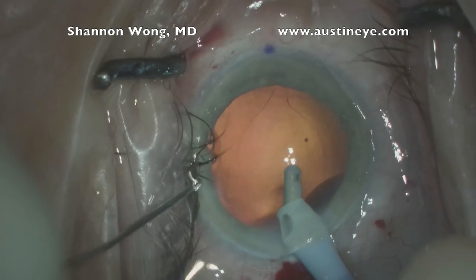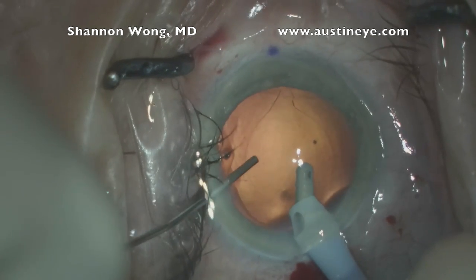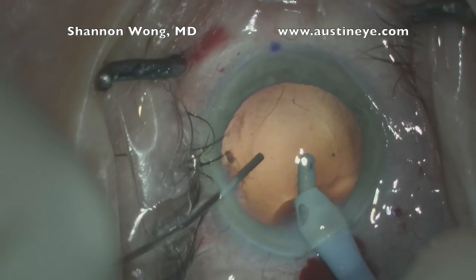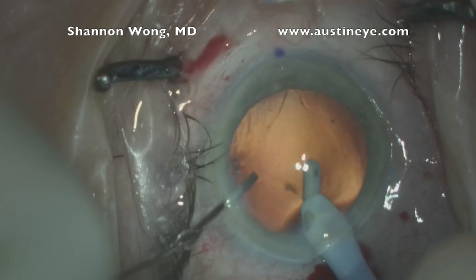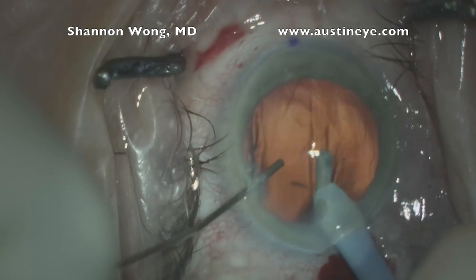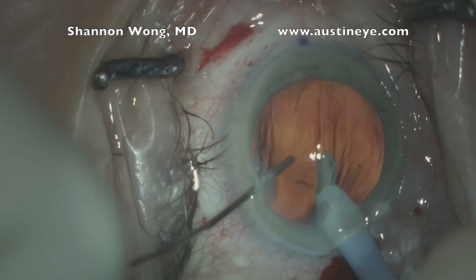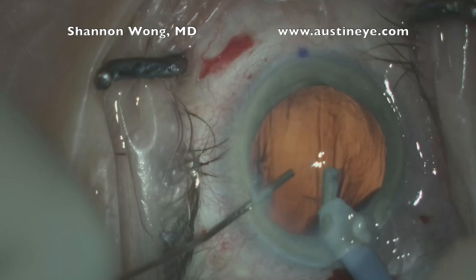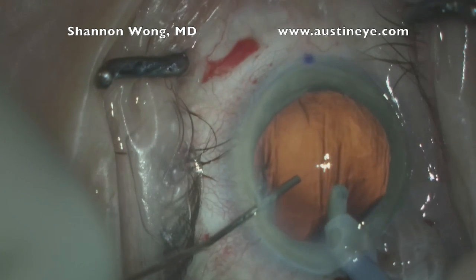Here again when we remove the irrigation and aspiration handpiece, we fill the capsular bag with viscoelastic so it does not shallow.